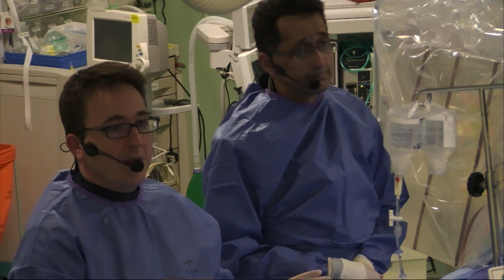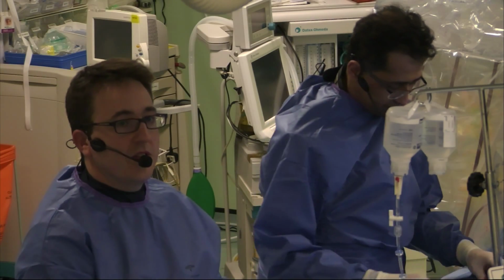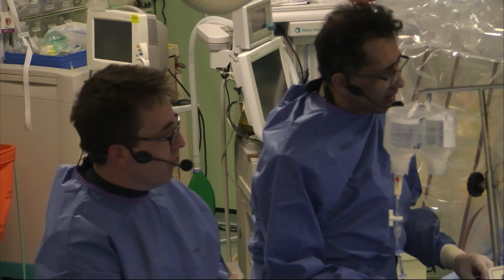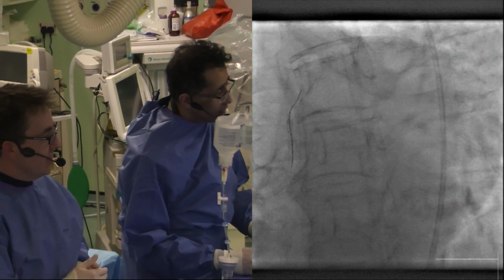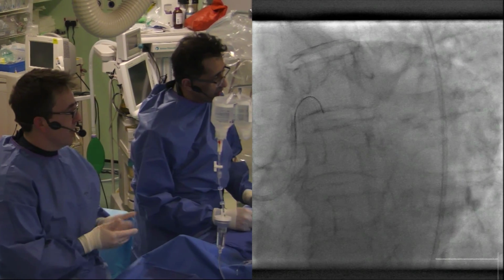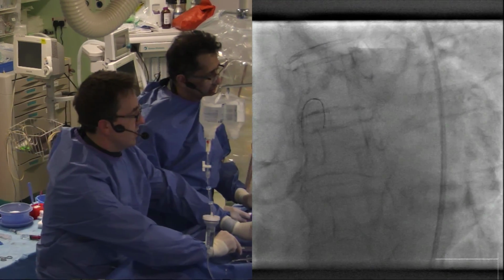Okay. So I know the plan here was to probably firstly take on the circumflex, if that's easy to get the wire down there. Yeah. And then whilst doing that, well, perhaps we'll watch you do that, and then we'll break off and have a little bit of discussion about why we do any of these measurements in the cath lab. So essentially we're looking to, there we go. So it's okay. Little test for me, just to make sure that is circumflex.